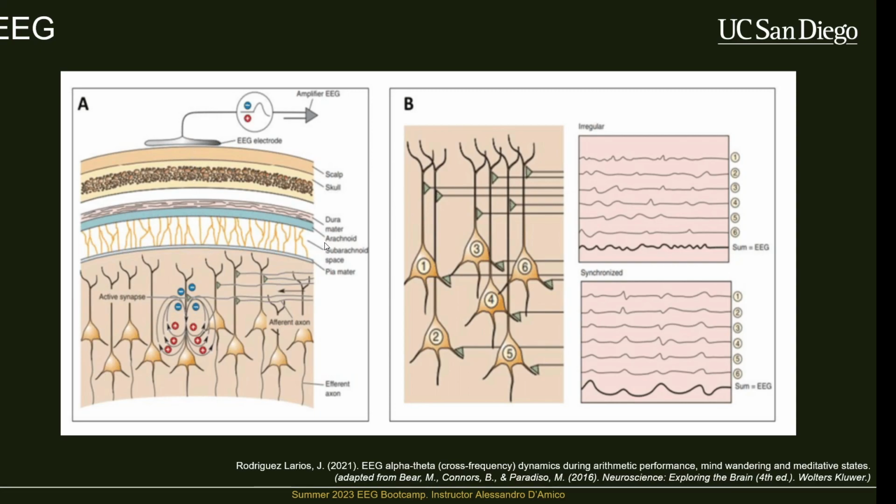So it's just smoothing everything. Averaging is classically a low pass filter, right? If you have some set of signals right here, let's say that these are some oscillation, and you average any subset of these points, for example, if we were to average these two points, we would get this square right here.